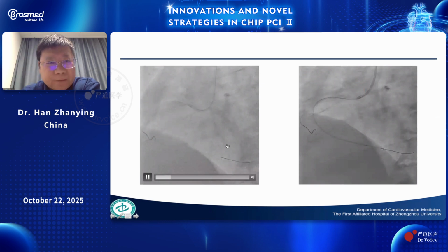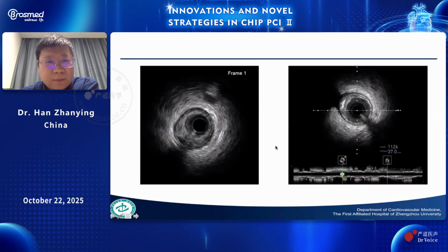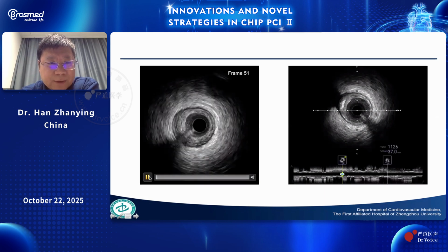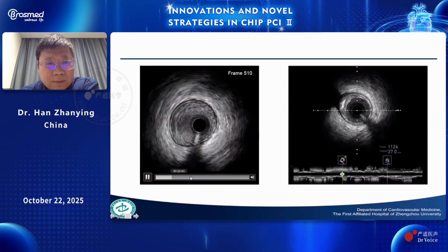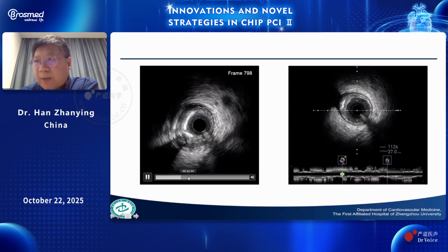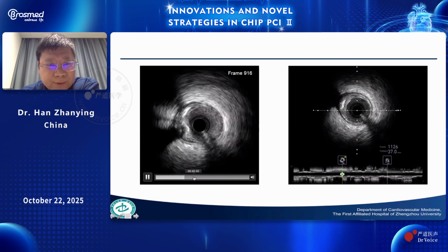After the predilation using this cutting balloon, perhaps we should do an IVUS check, but because of the time, I'll show you first.